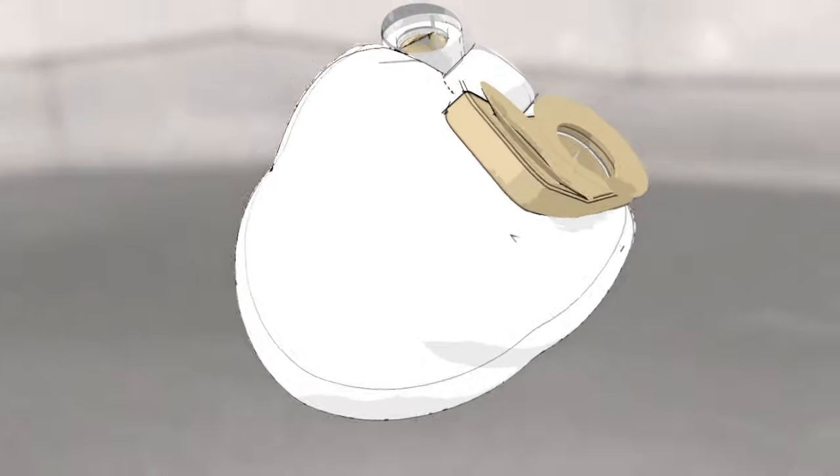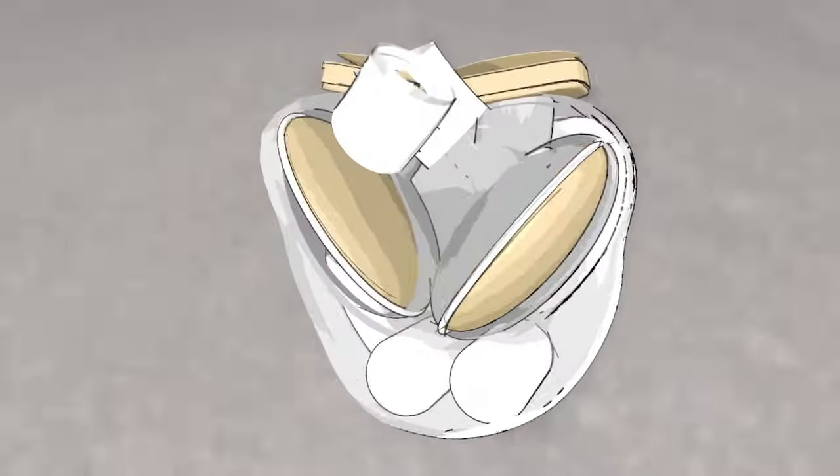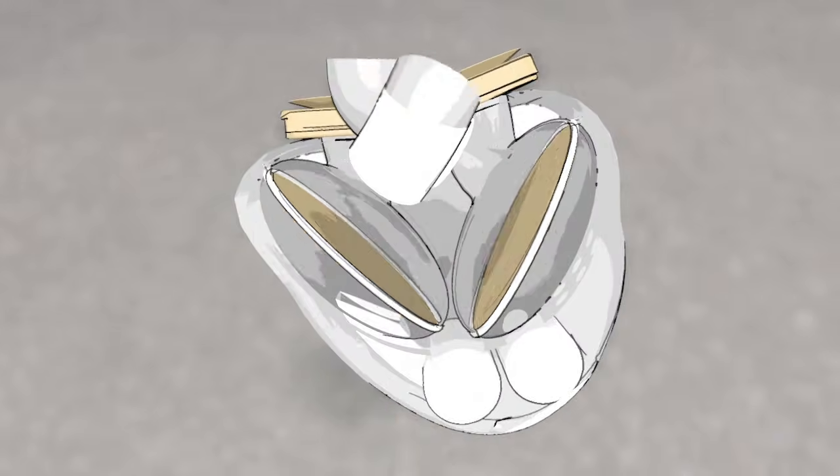Artificial hearts have a hard plastic protective casing and weigh 900 grams. They operate like a natural human heart, have two ventricles and even beat.